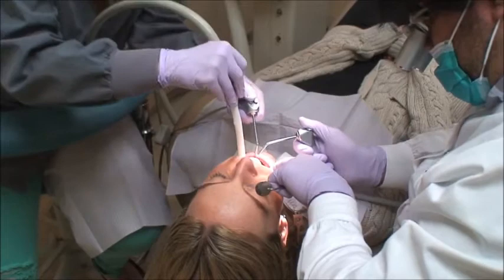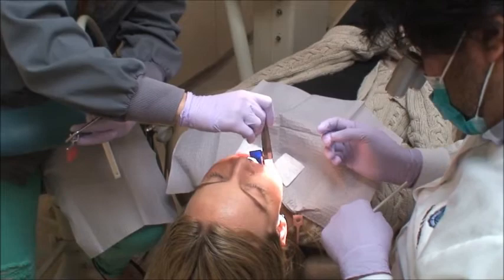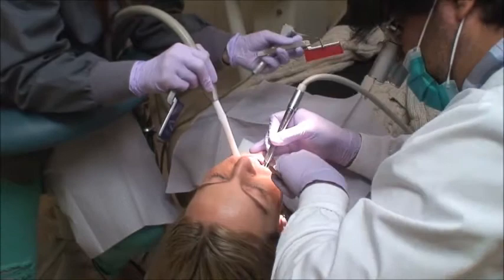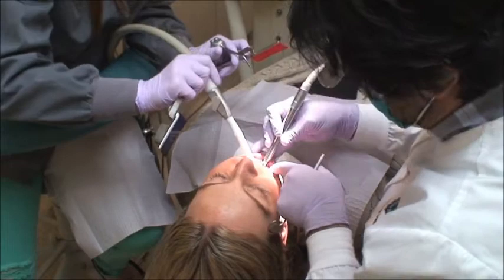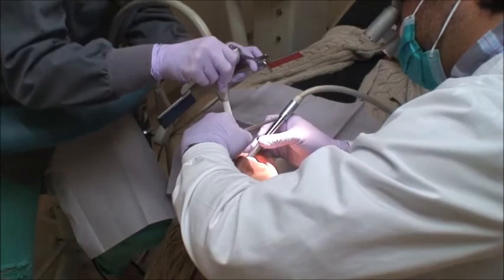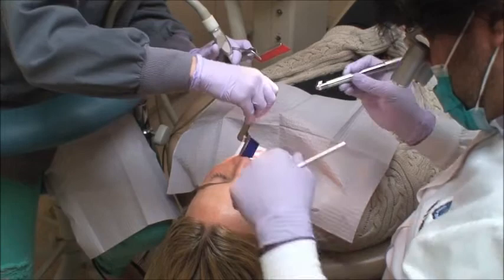The assistant is constantly drying the mouth. As you can see, the assistant places the plier covering one entire half of the mouth with the full length of the paper and asks the patient to tap twice. The assistant has in hand the air-water syringe, the plier, and a second plier for the centric bite. The reason I like to have two extra pliers and extra paper is so that if one drops or gets wet, the assistant can immediately switch to the next — keeping things efficient and fast.